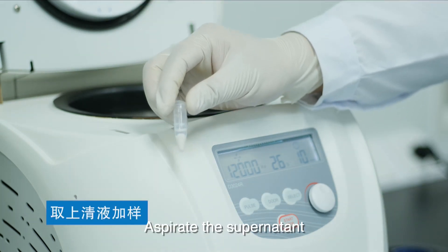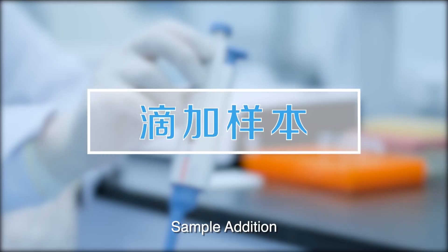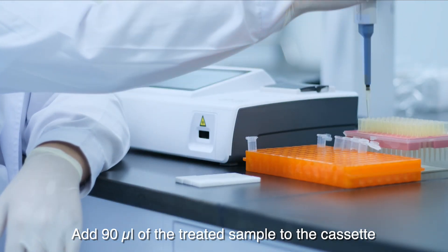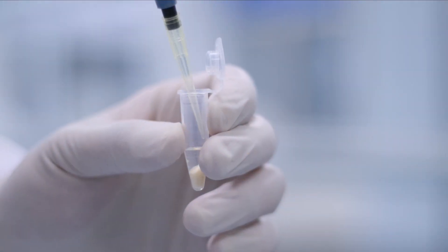After centrifugation, aspirate the supernatant. Add 90 µL of the treated sample to the cassette and pipette the supernatant.